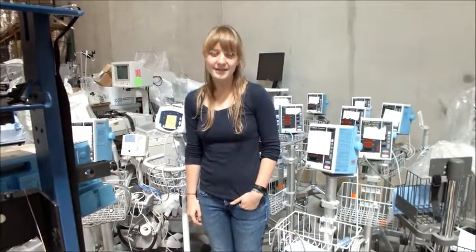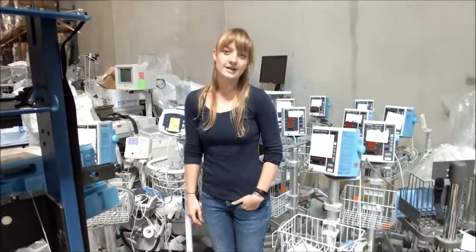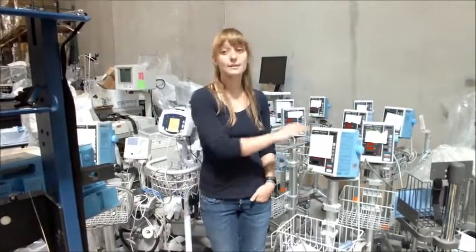Hello volunteers, my name is Emily. I'm an intern at Project Cure and today I'm going to be teaching you how to test a blood pressure machine.